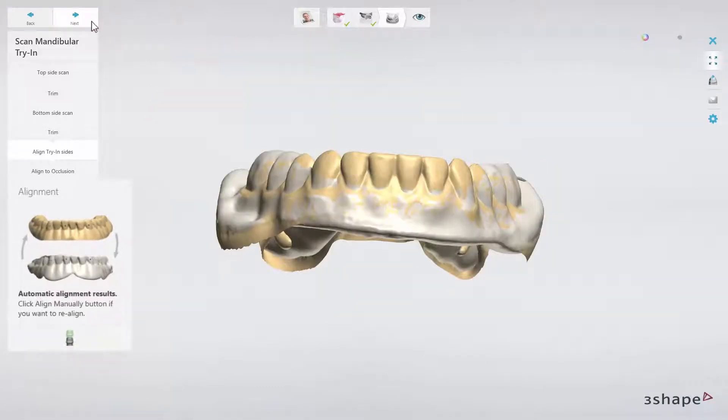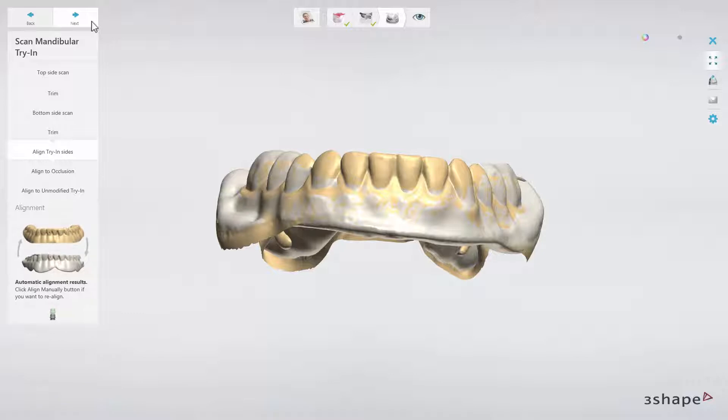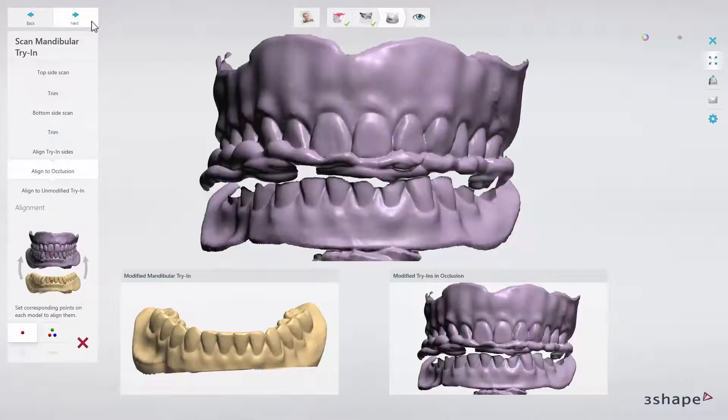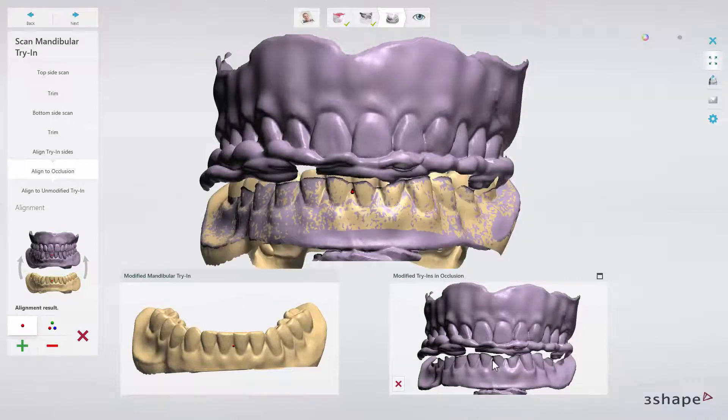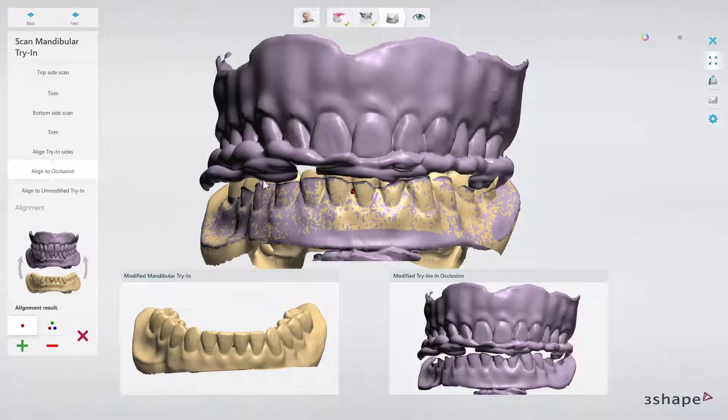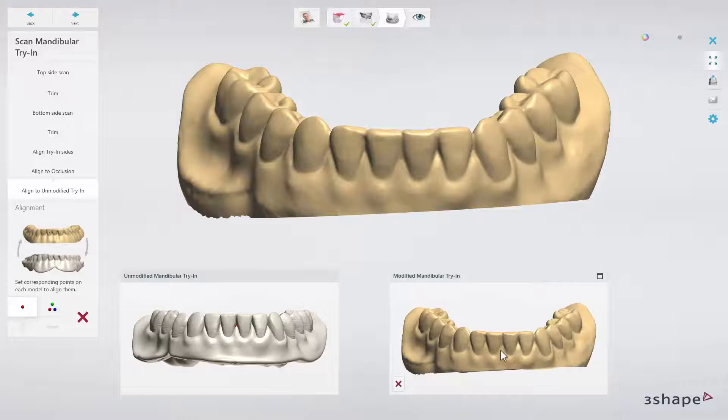When scanned, check automatic alignment of both sides. Adjust if necessary. Then click next to align the scan of the lower try-in to the new bite using one or three-point alignment. And finally, after clicking next, align the modified try-in to the unmodified try-in design.